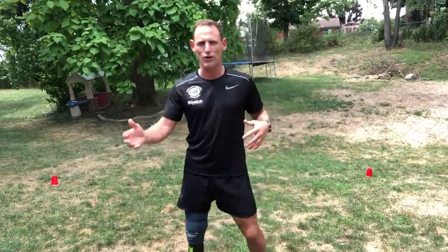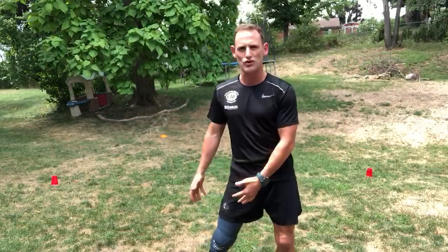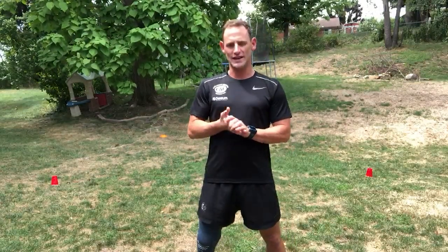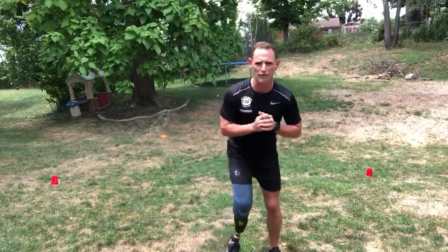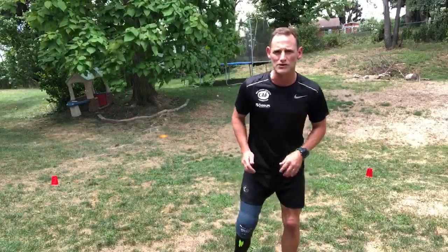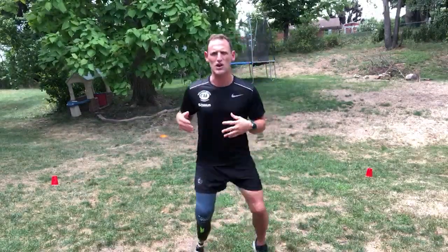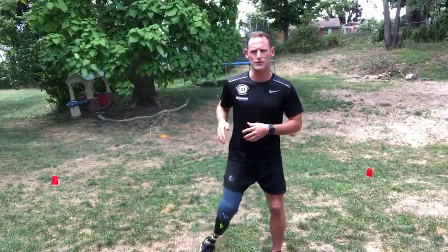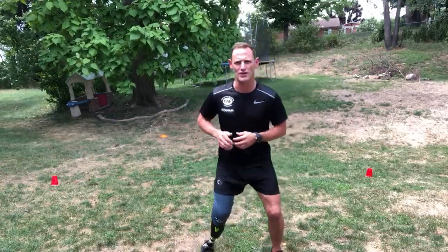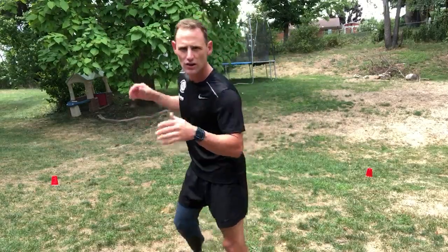All right, next drill, it's gonna be again laterally side to side, and we're gonna be working on strength, stability, coordination, again, pressure in our socket. And what we could do is when we're pushing off, going side to side, you can really engage your glutes and your leg muscles. And when you're on your prosthetic side, we're gonna be on our toes a little bit, and I get to really push off and use that carbon so you get some push off. But we're just gonna be side to side in between these cups here. It's gonna look a lot like this.